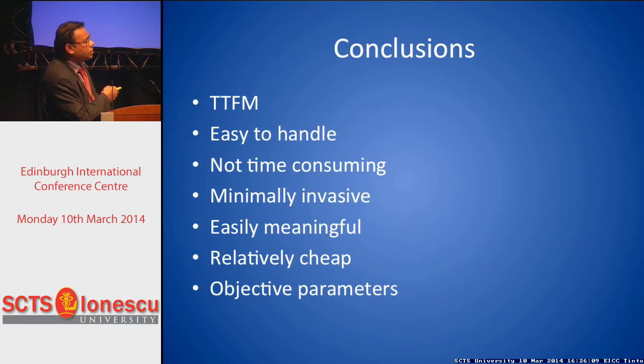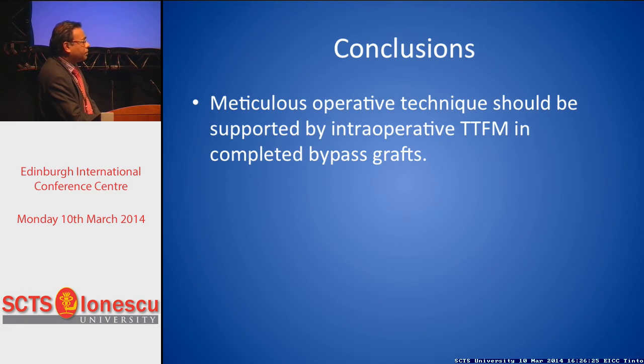So in conclusion, TTFM ticks all these boxes. It is an easy method. It is not time consuming, does not need catheterization or iodine contrast, provides easily meaningful data, and provides objective parameters. So my last slide, David. And therefore, I believe meticulous operative techniques should be supported by intraoperative TTFM in completed bypass grafts, and that will improve results. Thank you, Vipin.